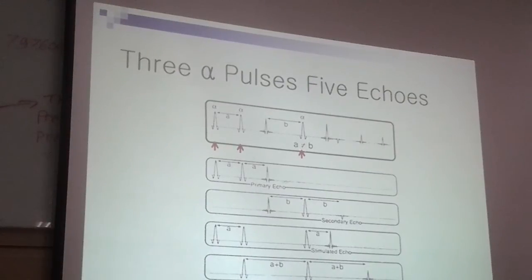The image contrast is different for each echo because the echo time is different. So we cannot say which echo generates the best image. It depends on the contrast of tissues. Some tissue has good contrast for one echo, while another echo generates lower contrast for specific tissues. So it depends on the T2 or T2 star value of tissues.